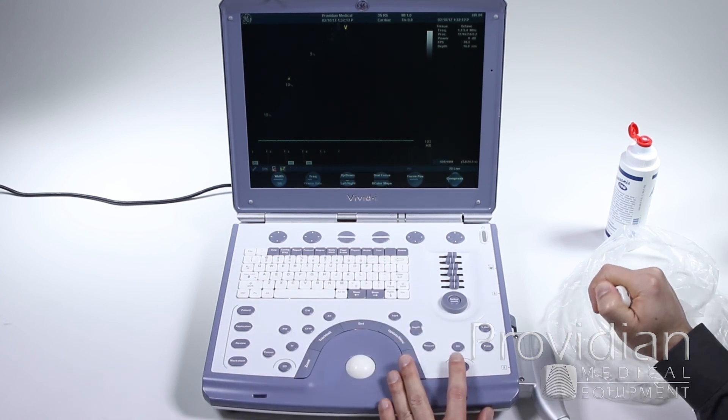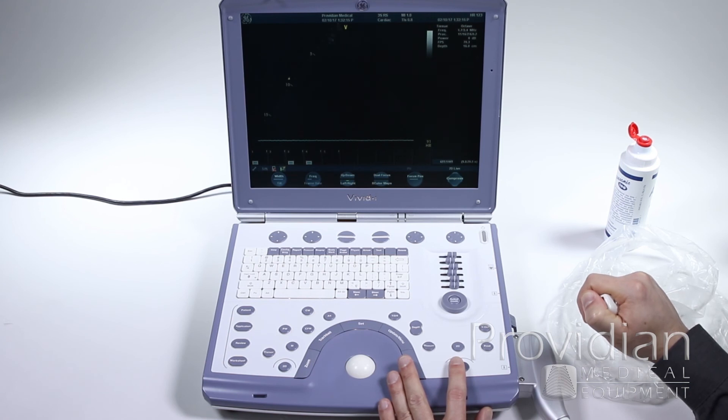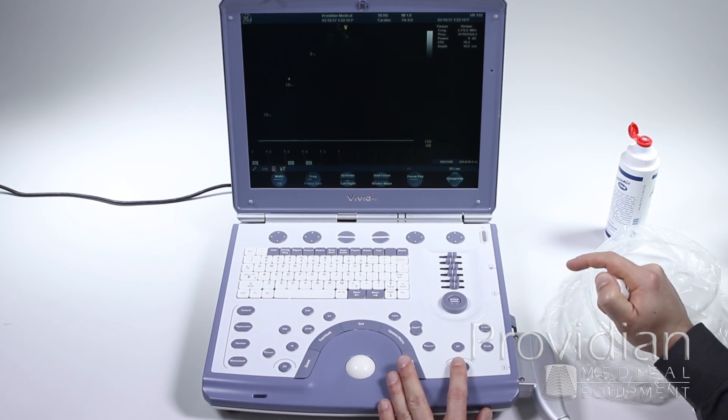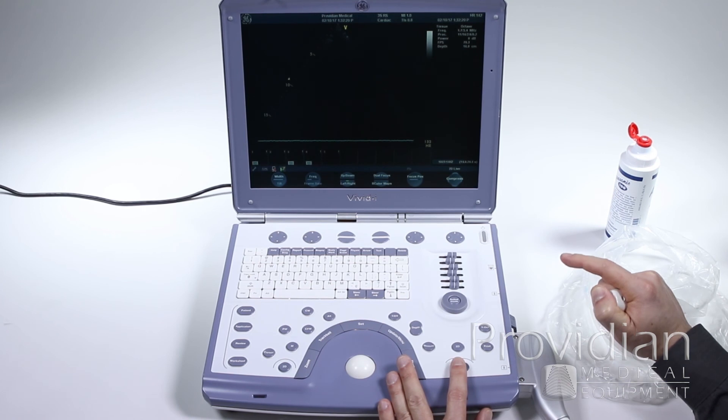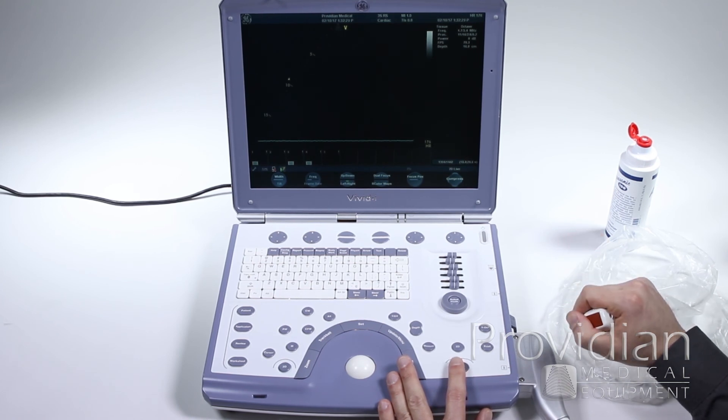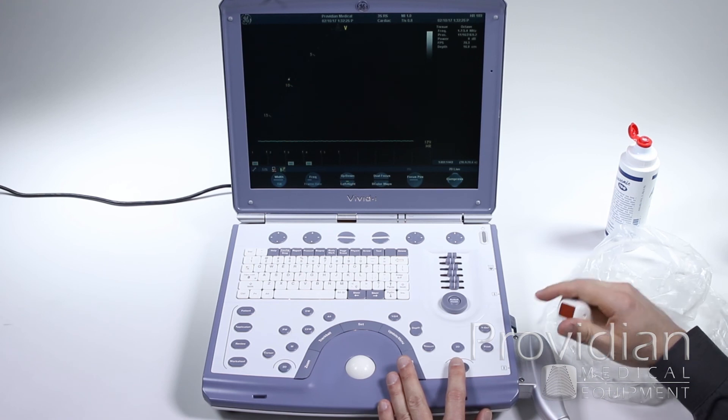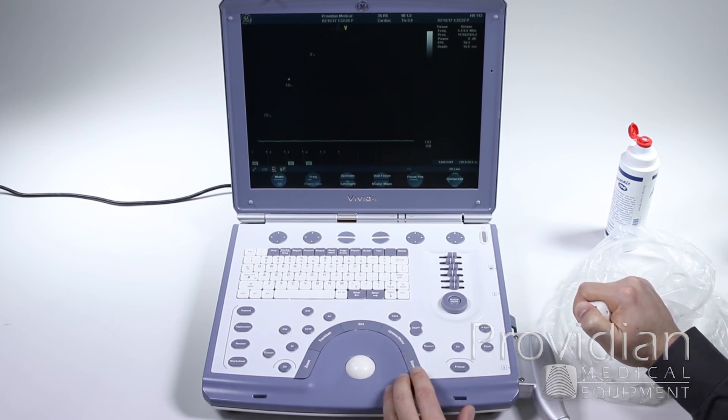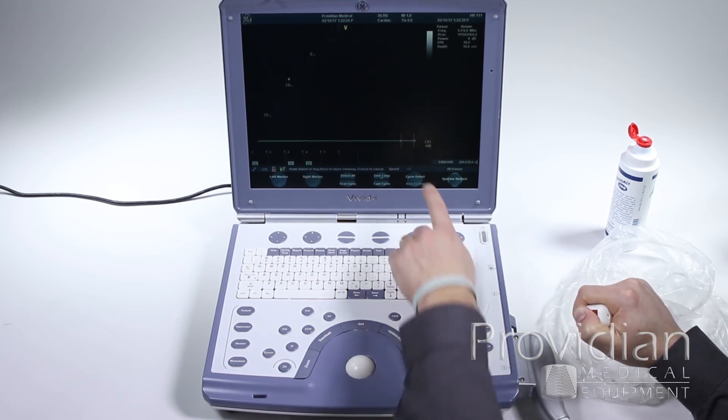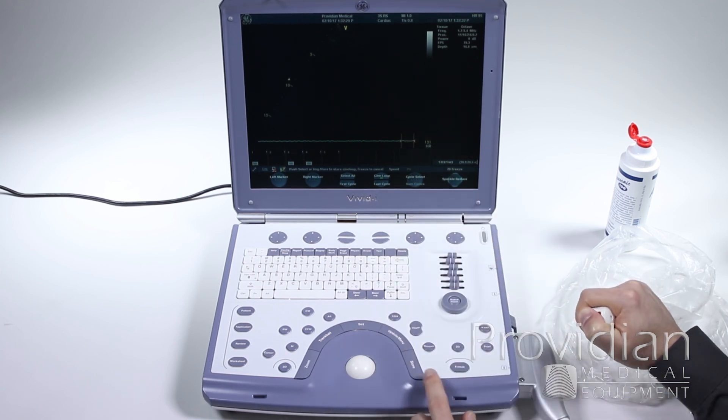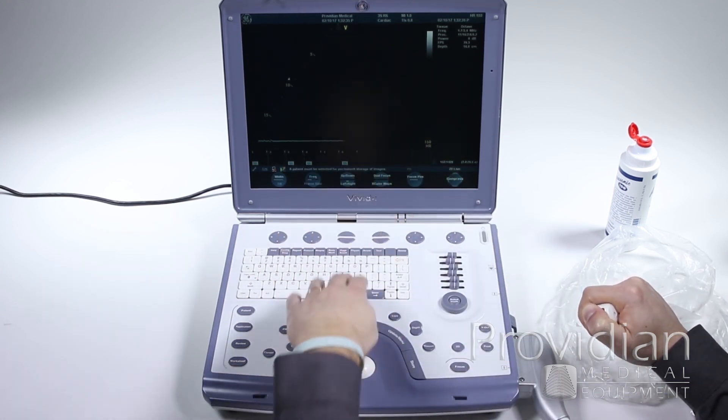So when you're in that live image, what it's going to do if you have an ECG attached, it's going to save that last heart rate cycle or however many heart rate cycles you have set up in the system setup, which is in the system setup video later on. But if I've just got it stored to save the last heart rate cycle, I hit store, it's showing me, okay, I've got the last heart rate cycle. I can hit store and it's going to save that loop.